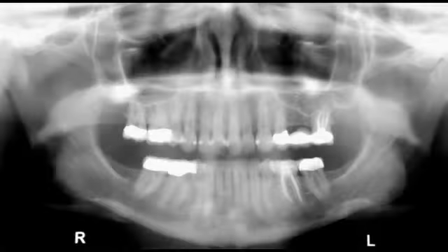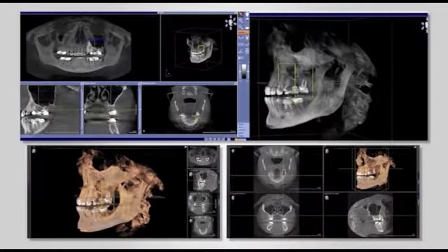And so we can look at the Panorex. You can use a Panorex if you want. You can say, oh, wow, look at that sinus in through there. And is there enough bone for the implant? And then we want to maybe go ahead and take a scan and really start to diagnose what would need to change in the biology to support the structure that we decided on.